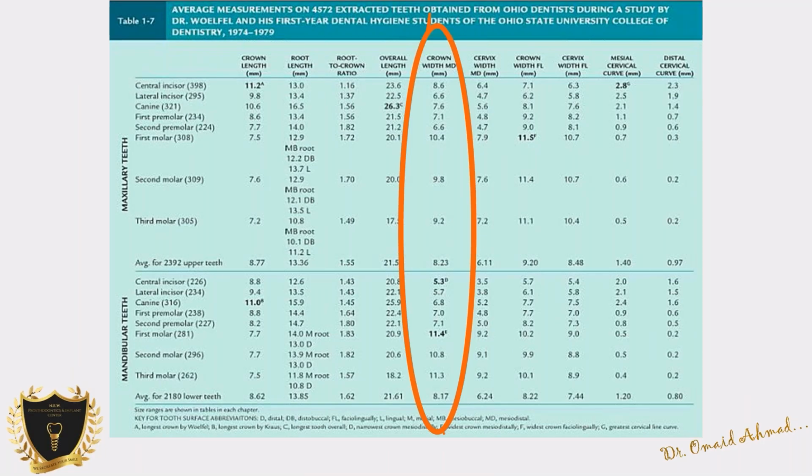This is something which also helps. In this chart, they also talk about the crown length. So you get an idea about mesiodistal and the vertical. So when I was talking about the interarch space, that's what my base reference is when I'm looking at it.